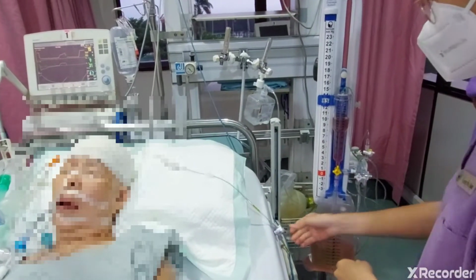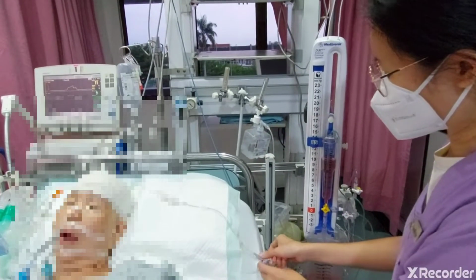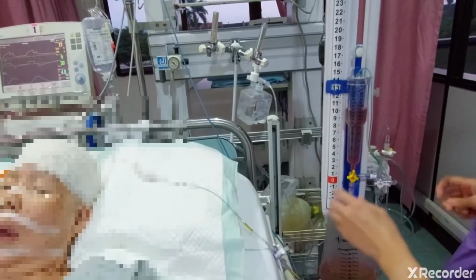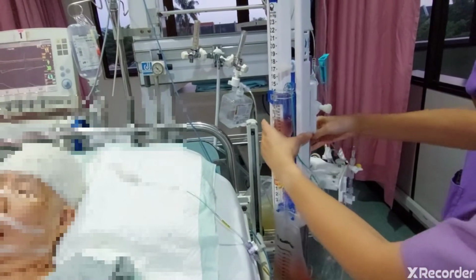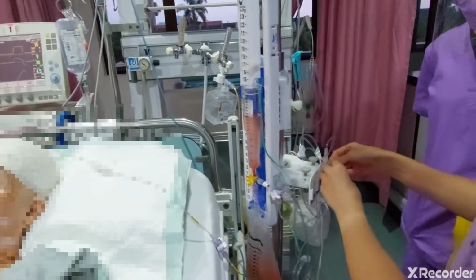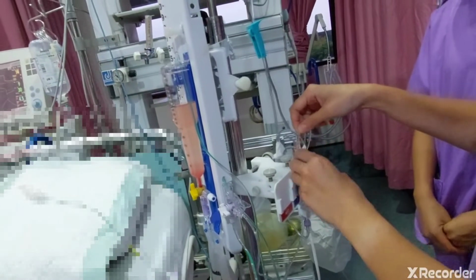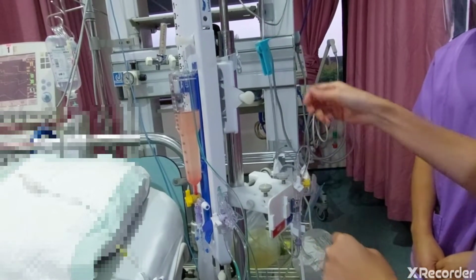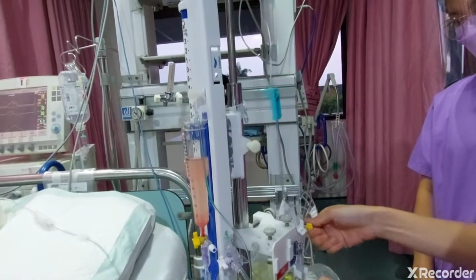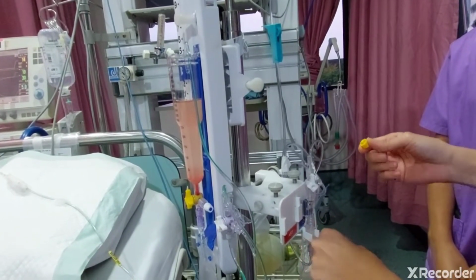Okay. Now we need to do the zeroing for the patient, for this EVD. So close this system. This is the EVD system. First of all, this port is atmosphere, this one is patient. So close to the patient, open to atmosphere. This one is open. We press some water out from here.